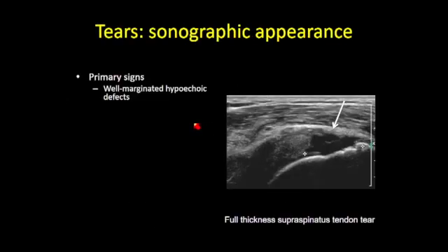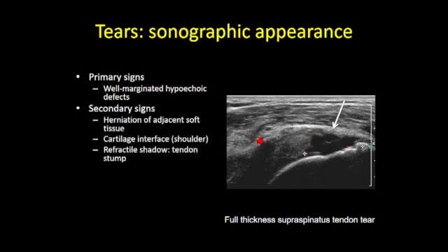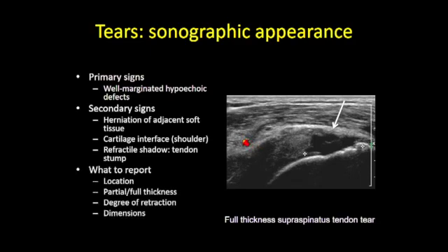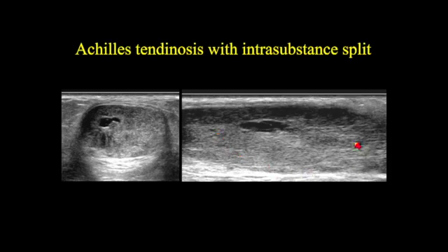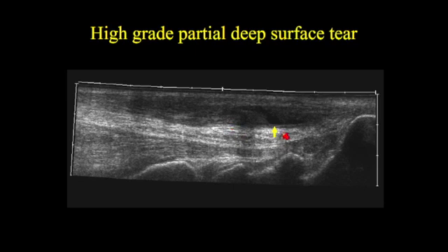Turning to tears: the primary sign is a discretely marginated hypoechoic abnormality within a diffusely abnormal tendon. When you identify a tear, you should report its location, extent, and dimensions. Here we see a tendinotic Achilles tendon with a discretely marginated hypoechoic defect entirely within the substance — an intrasubstance tear. This high-grade partial-thickness tear along the deep surface of the Achilles tendon is in the so-called critical zone of diminished vascularity, a typical location for partial-thickness tearing.